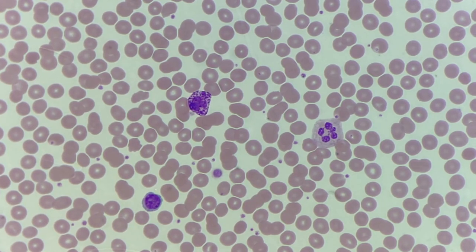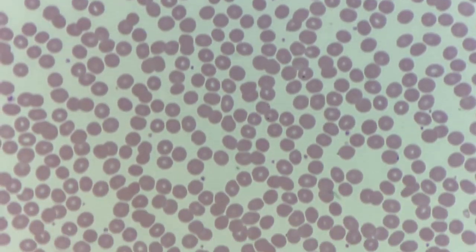Normal platelets should be well granulated; however, in certain conditions they can be hypogranular or have no visible granules at all.